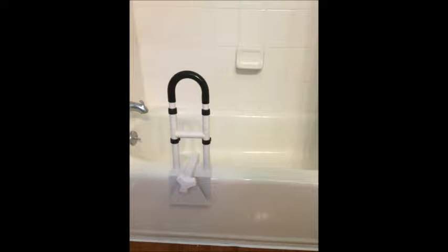A bathtub safety rail is a device that provides extra support when getting in and out of the shower. The bathtub safety rail can be attached to the side of the tub and removed when no longer needed.